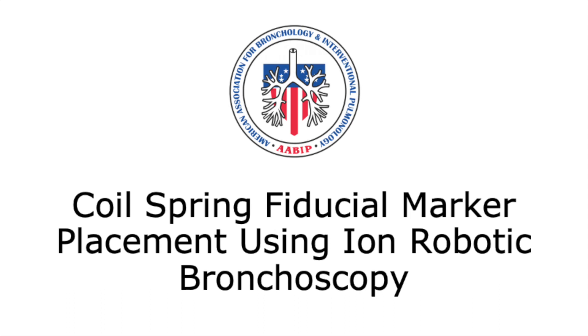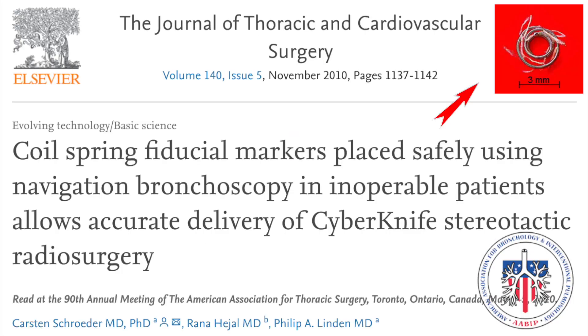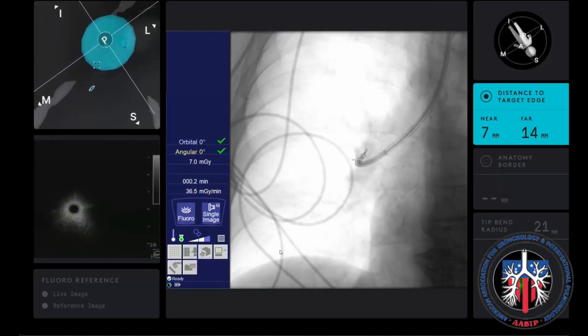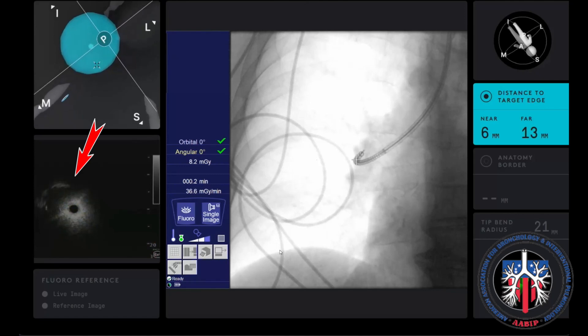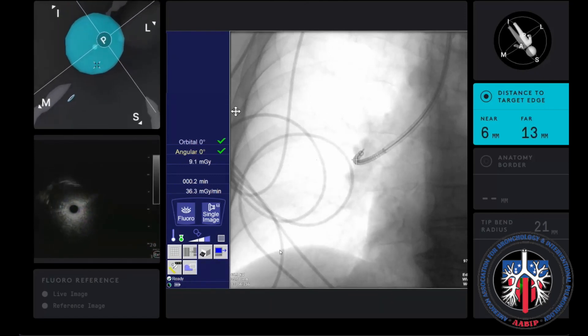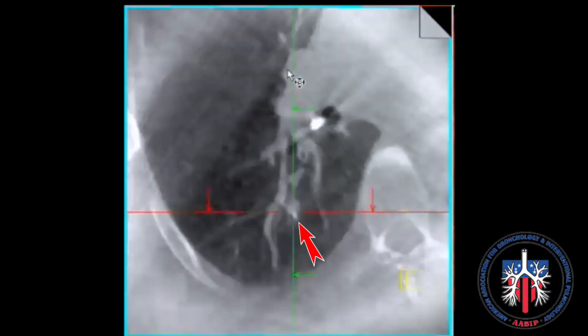The other type of fiducials used to mark lung nodules are the coil spring fiducials, which have been used in multiple cases to help mark lung nodules. This is an example of a case involving an 8-millimeter lung nodule in the right lower lobe. Navigation proceeds to reach the lung nodule, seen as 8-millimeter and eccentric on radial EBUS.